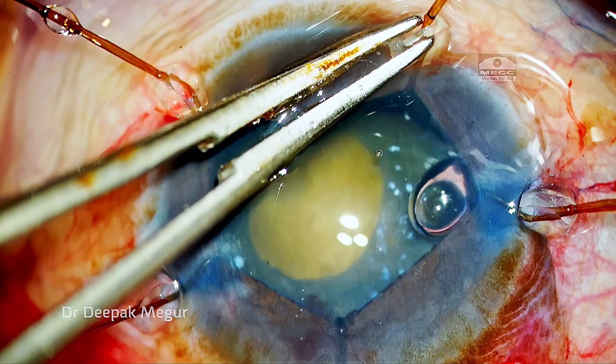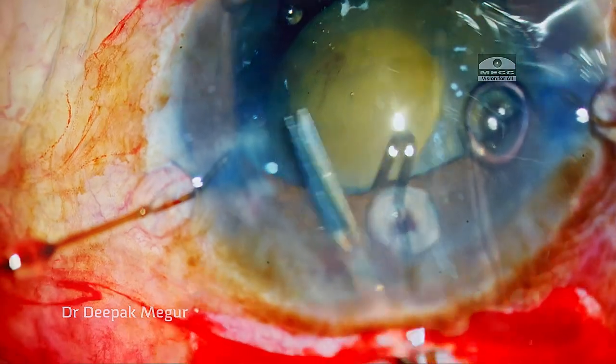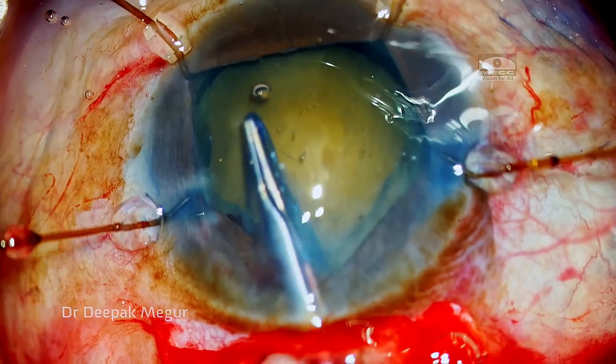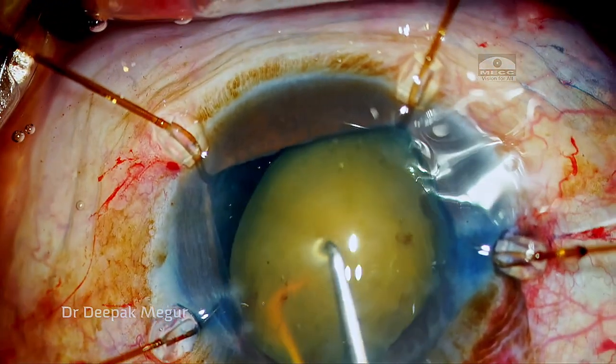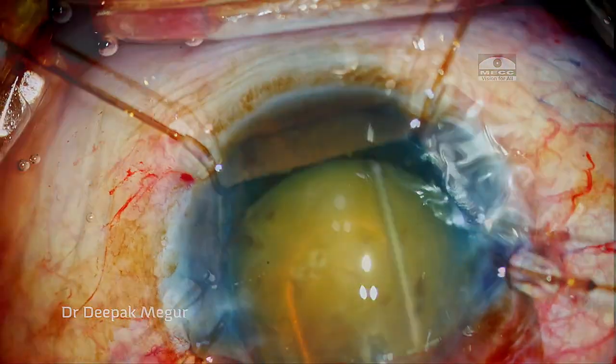So I finally conceded defeat and went back to the hooks to bail me out of the situation. As the four hooks are in place, the picture dramatically changes — everything looks so routine now. I can see well; I know what I'm cutting and tearing.